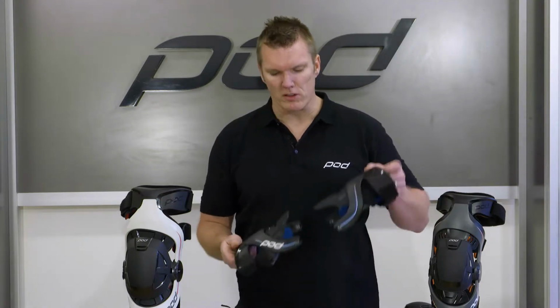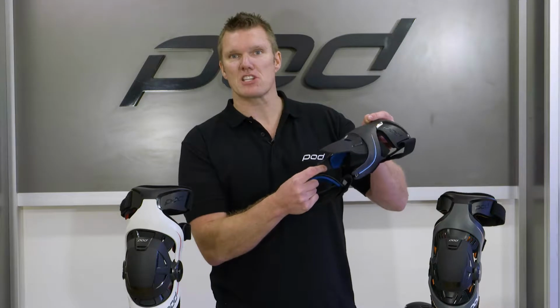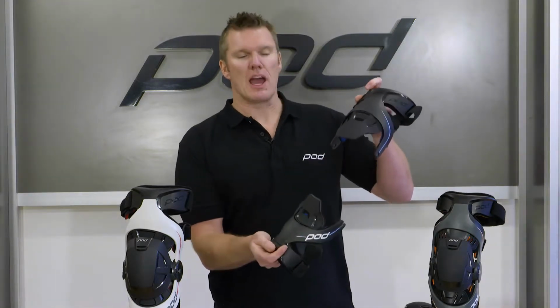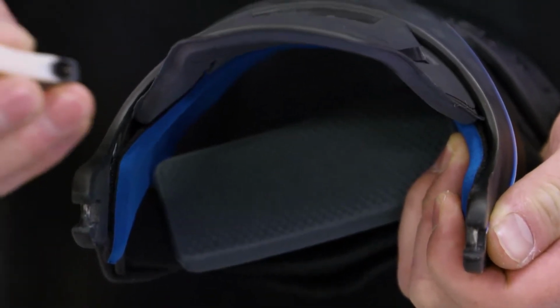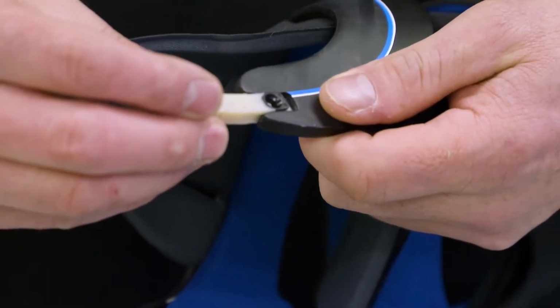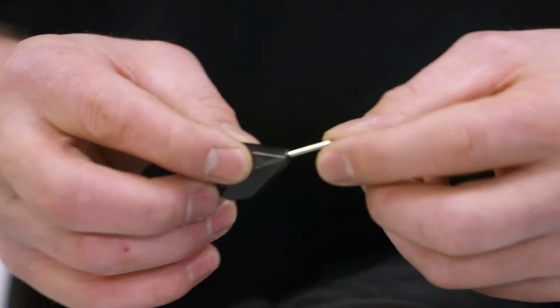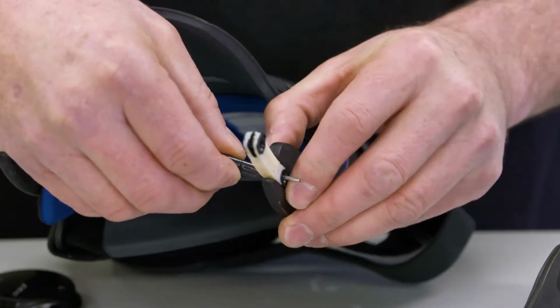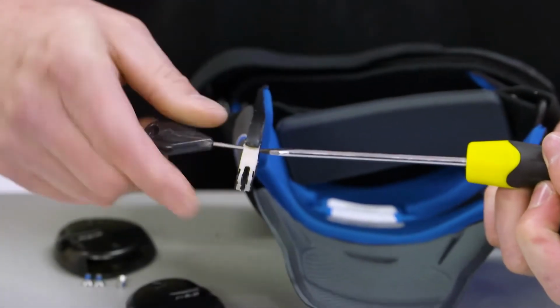So now we'll move on to reversing everything we just did in actually reattaching the new ligaments, sliding the housing onto the upper frame, and then reattaching the lower frame. Having unpacked all the pieces of the hinge rebuild kit, slide the new ligaments onto the upper frame. So with those both in place, first grab the female, the larger of the 2 screw parts, and place those on the inside of each of the ligaments.